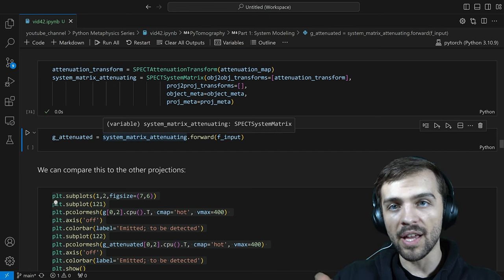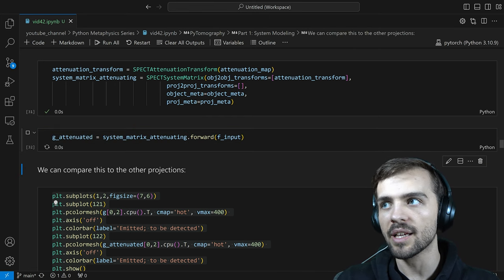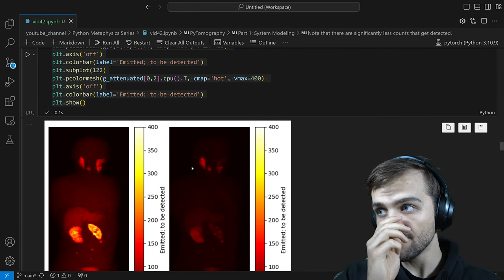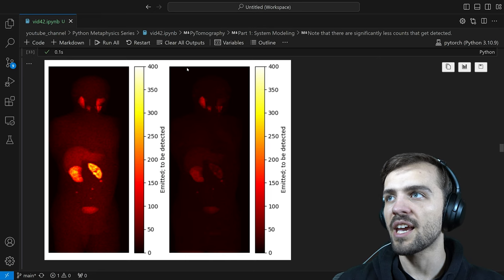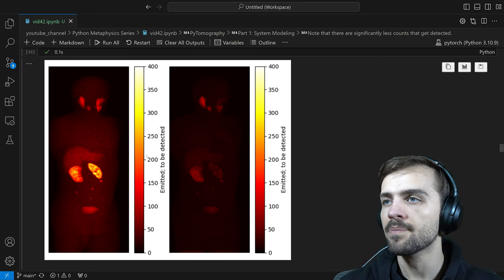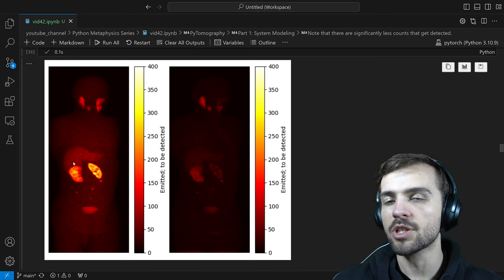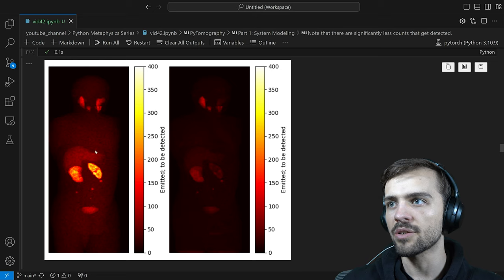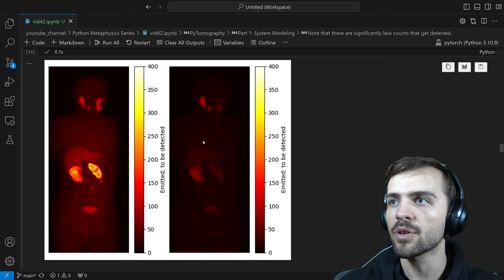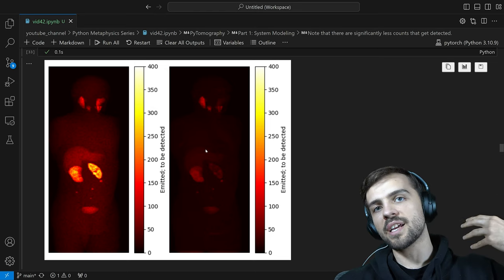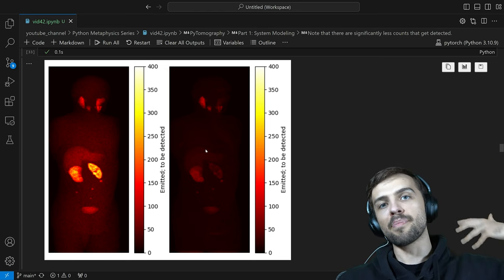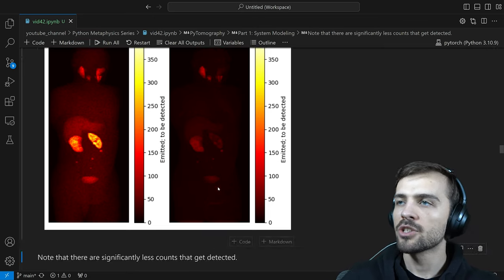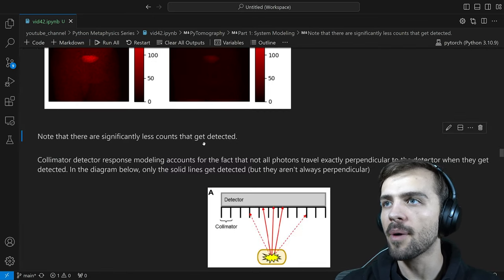Now I have a system matrix that models photon attenuation. Using this more advanced system matrix, we can see what the SPECT image would look like. Comparing G_attenuated to the original G — with the same color bar scales — the attenuated image is much darker because many photons have been attenuated. The ones attenuated were likely those further back in the patient from the detector. That's the first thing we need to account for when modeling the SPECT system.